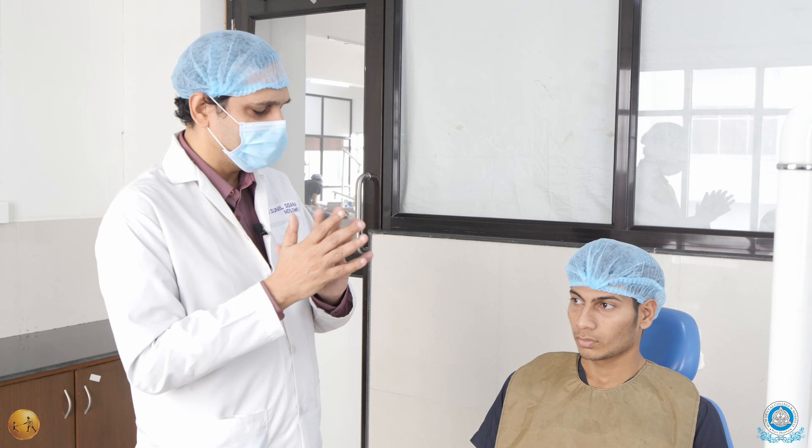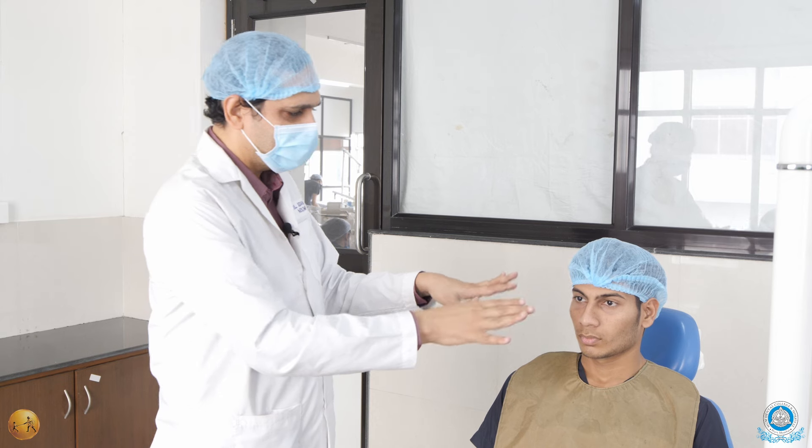Hello viewers. Today we will be talking about patient position for the extraction of teeth. Once the patient is fit for extraction, having completed all the medical history and investigations, the patient is made to sit on the chair. You keep your armamentarium on the trolley with the local anesthetic, everything kept ready, you scrub up and wash your hands, do the painting of the patient, and wear your sterile gloves.